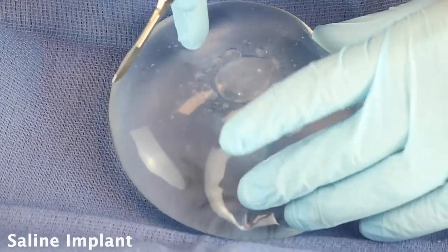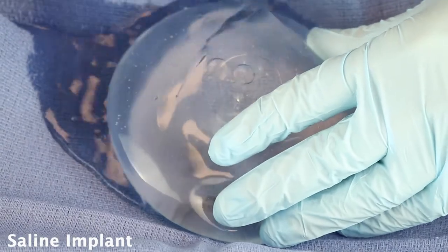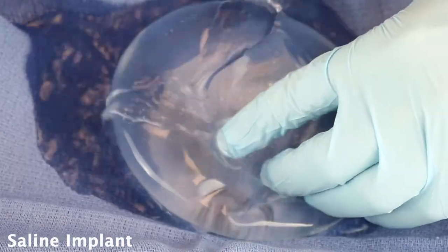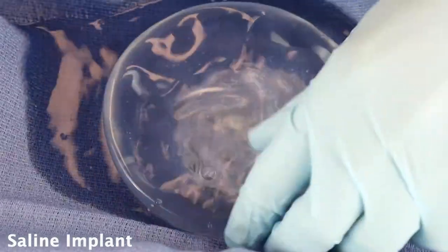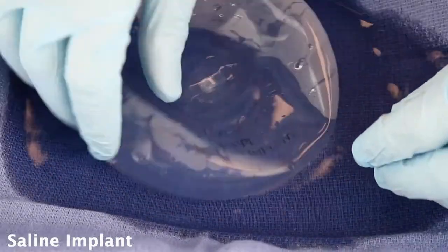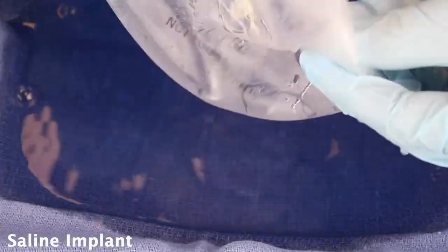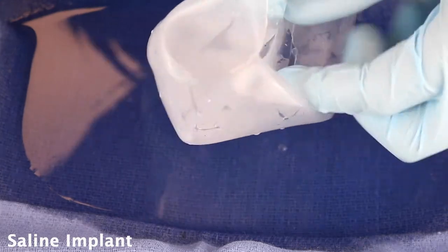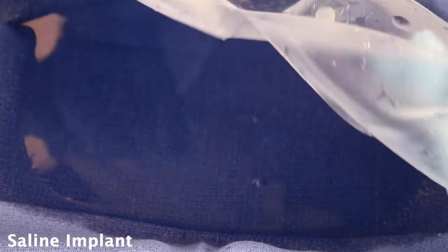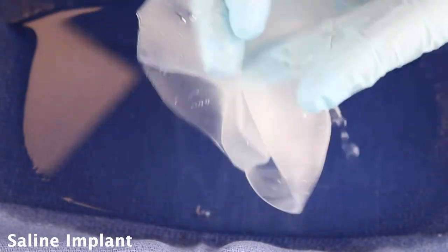This is a saline implant, and when these rupture you can see all the saline just comes out, and within seconds it's completely flat. This is all the salt water that was inside, and your body actually absorbs all the salt water — it's then just left with a silicone shell. You can see that can degrade, and this is what would be taken out after an implant rupture.